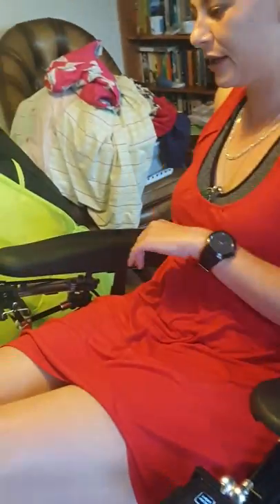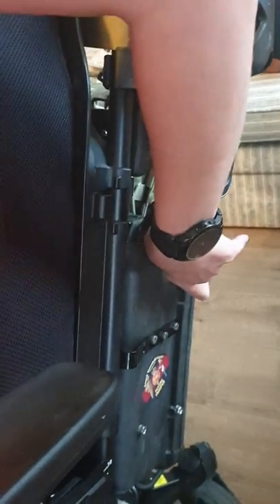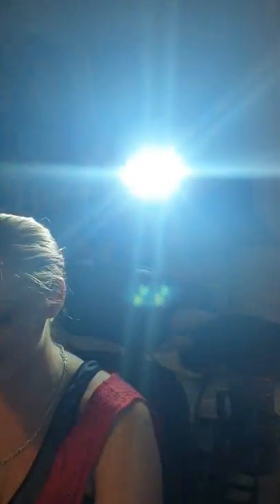I've got two places where I can switch on my lights and battery — I can switch it on from there or from the back, though it's easier from the back. So there's a main switch there and then off, so the lights go out, and on, they come on. I have my strobe lights, which are yellow flashy lights. When I'm doing support ops and marshalling and things, I can still help out and marshal — damn it, I want to. I've also got my work light slash flood light. Look at how bright it is — it's bloody blinding. I'm going to turn it off because it's killing the camera.